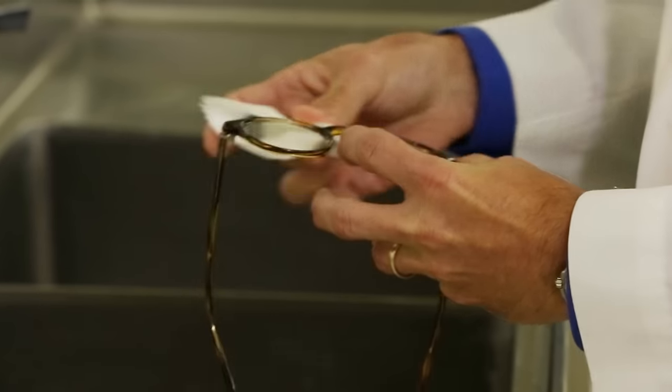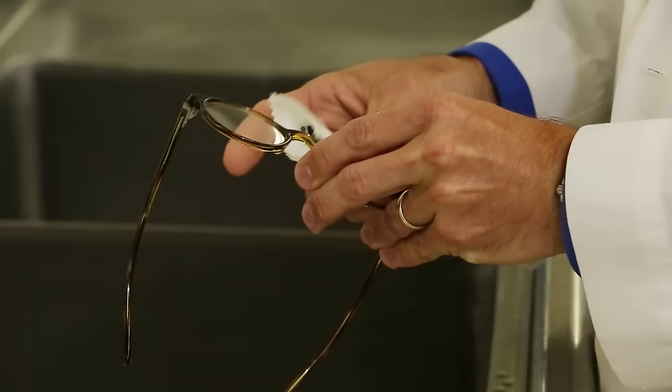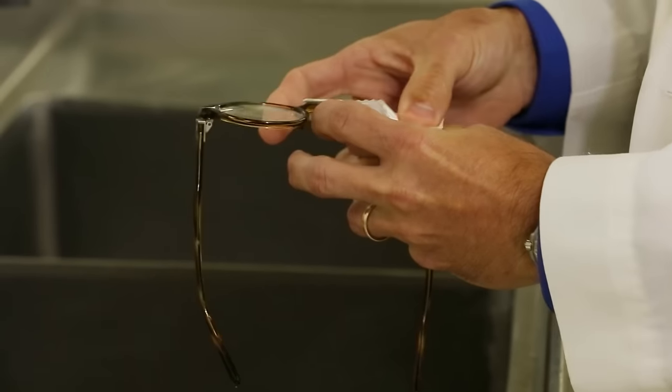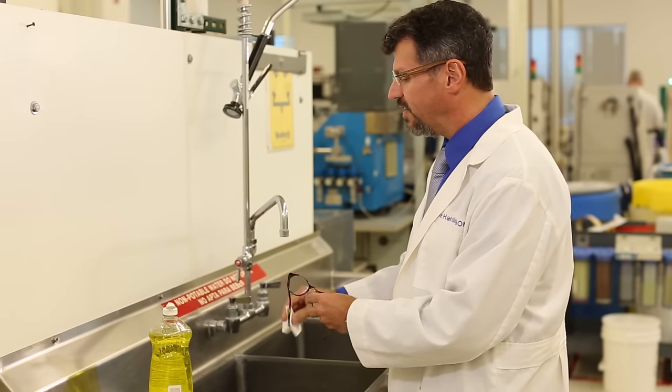What you don't want to use is a paper towel because that's actually got wood fibers in it that can scratch your lenses. And for the same reason you don't want to use your shirt tail because you probably got dirt or dust or something else that could damage your lenses.